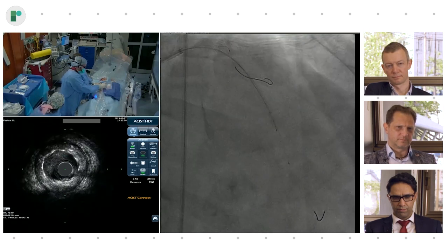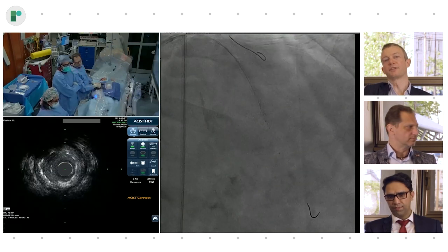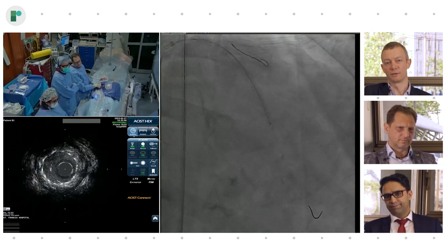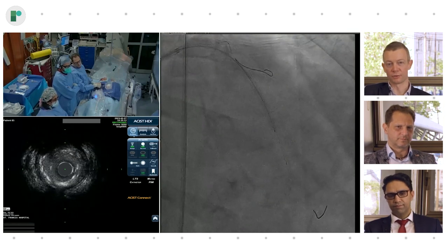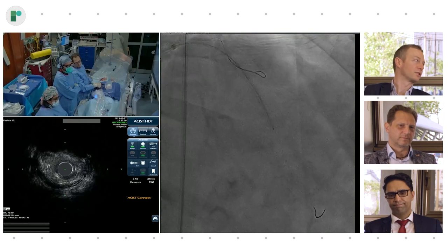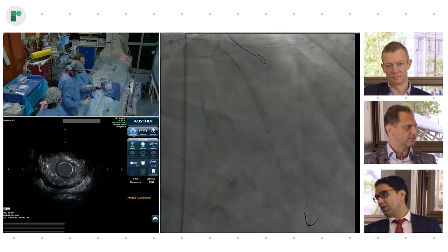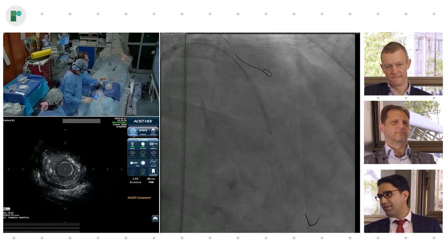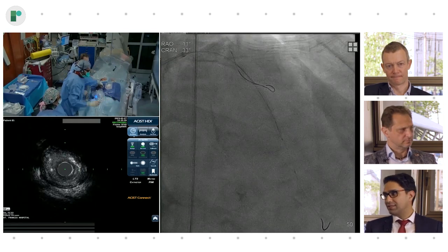Yeah, there's definitely... Okay, so I'm going to go... So these are the difficult cases, right? But I think the only thing we can say for certain is that there is no healthy reference distal lumen. And whether there's a dissection or a rupture or some soft ruptured thrombotic material, it's very difficult to tell, right? And so, of course, one of the things we can do here is switch back to physiology. And so that's what we're going to do next, because we have this ambiguity, we fixed the proximal lesion and now we can assess the distal vessel.